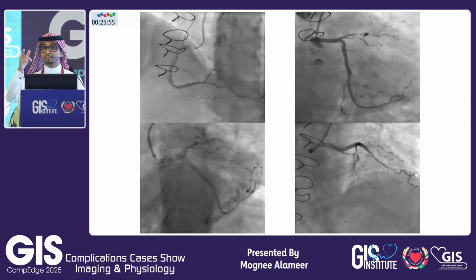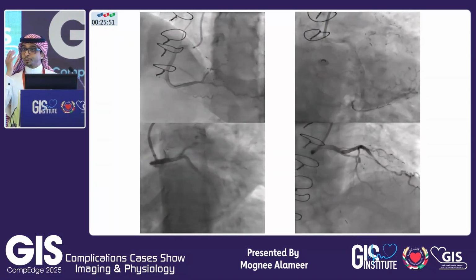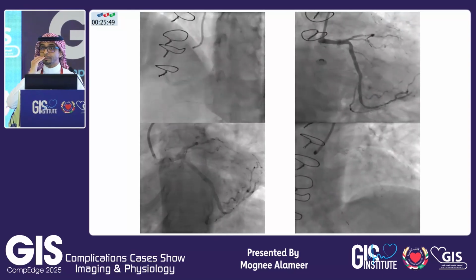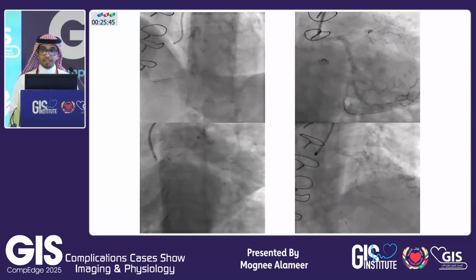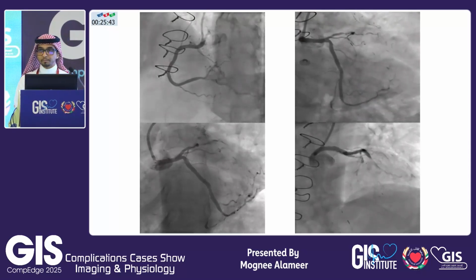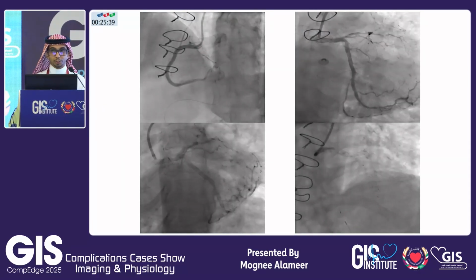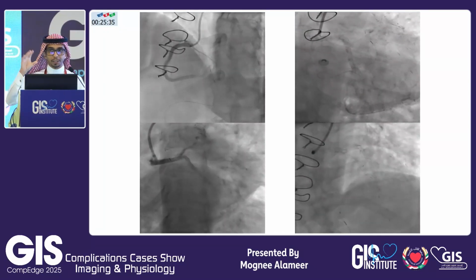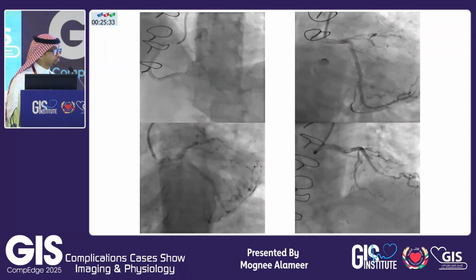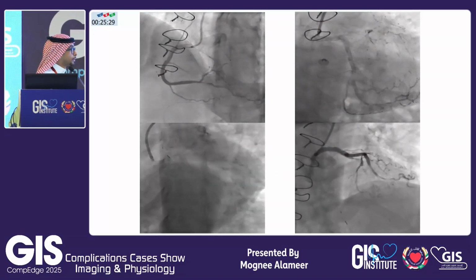Yeah. Ostial PDA. You revascularize the right coronary for what? Sorry. You open the right coronary for what? Exactly. But he mentioned that he will leave it. You open it for the distal line. Yeah, thank you. Maybe the ostial PDA, just balloon it, maybe drug-coated balloon, and that's it? Let's just continue with the presentations. We'll leave the comments shortly. Mognee, go ahead, please.